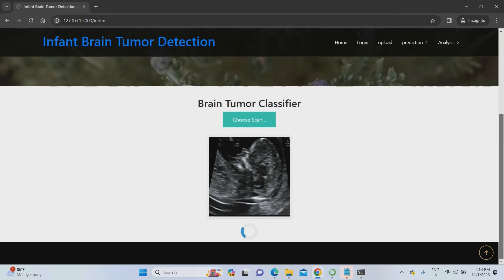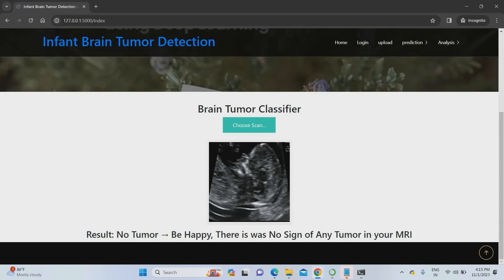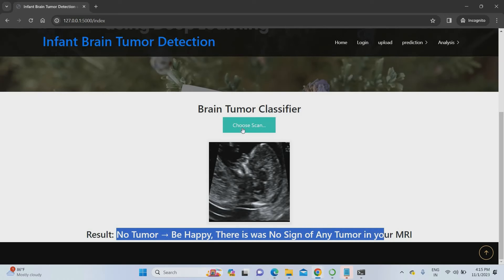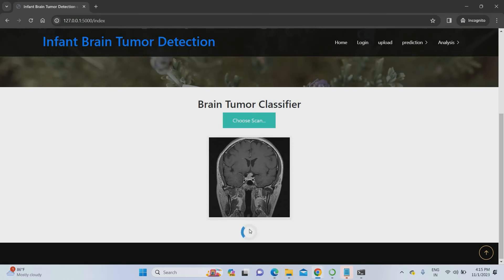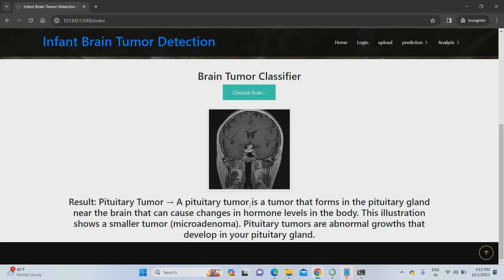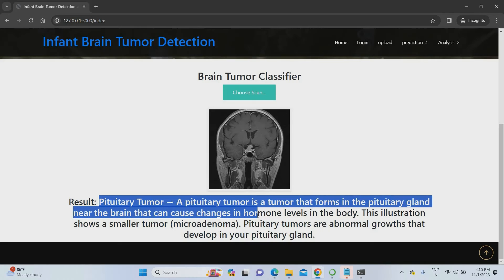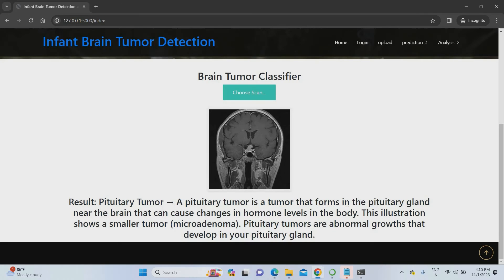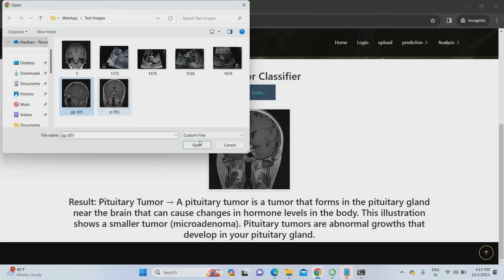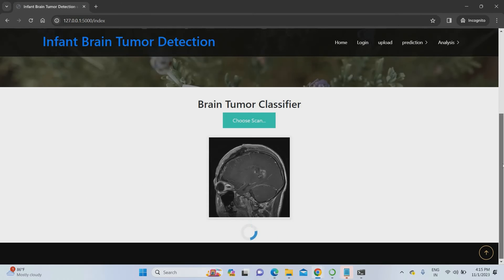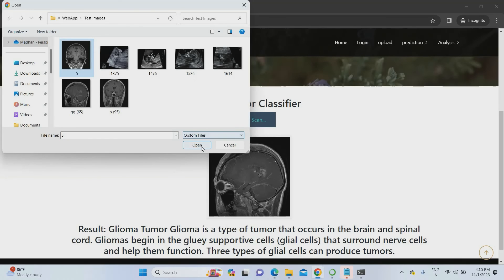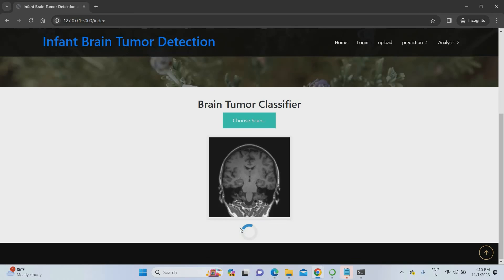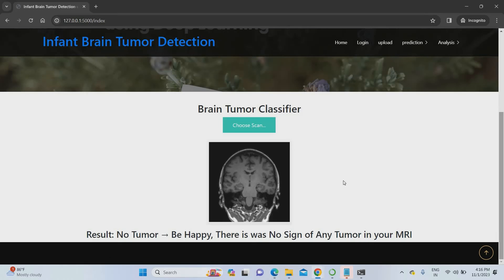I am using another image now. This image shows no tumor — you can be happy, there is no tumor in your scanning. I am using one more image — you can use MRI images also, as mentioned earlier. MRI images of infants also work perfectly. The result shows the image contains pituitary tumor, found in the pituitary gland, which changes the hormone level of the body. Everything about the tumor is given in the results. I use one more image — it belongs to glioma tumor. It works perfectly for each and every tumor type. Then one more image — no tumor — perfectly it works.